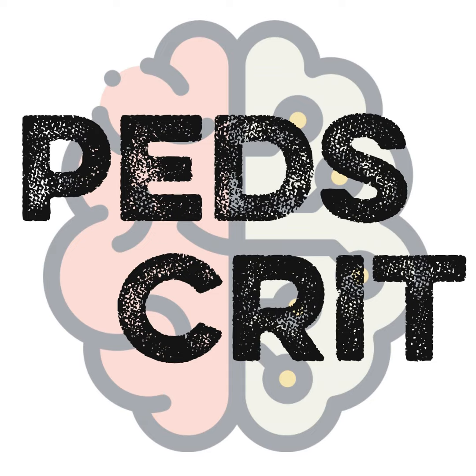So is it fair to say you would wait to see some evidence of lung disease start to recover before you would remove the paralytic, or not necessarily? Yes, as soon as the patient is on the oscillator and the recruitment is done and the patient stabilizes over the next hours, we are going to start doing the so-called MAP challenges. We're going to seek the lowest mean airway pressure for that patient. We're going to aggressively wean the oscillator again. We do not wait for the chest radiograph to improve. So we wean and we stop the neuromuscular blockade. Then after 24 hours, we observe the breathing pattern, and if the patient doesn't show vigorous breathing, then we keep it stopped, and we further wean the oscillator.